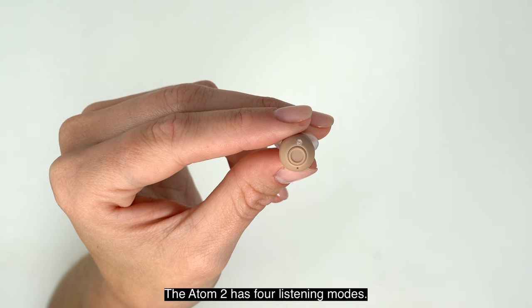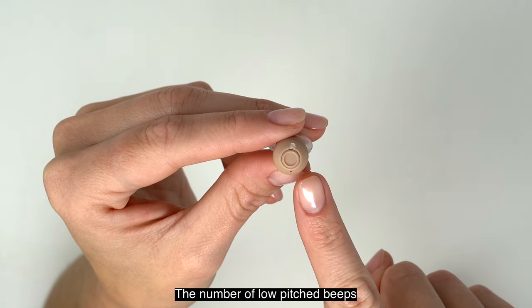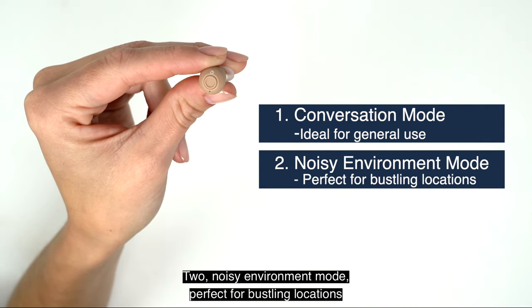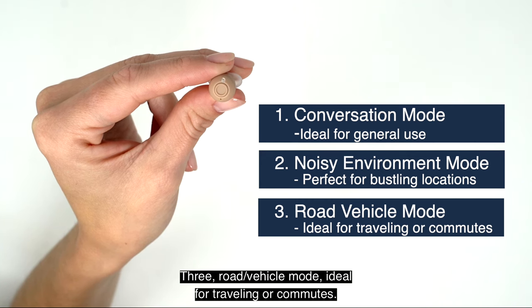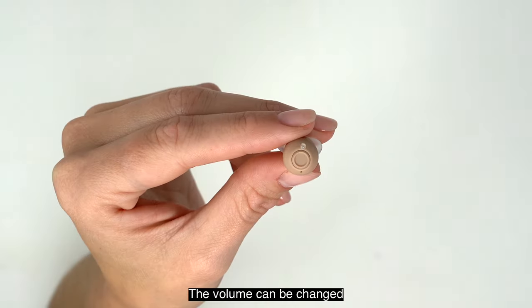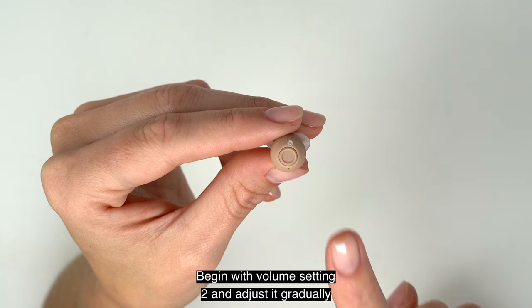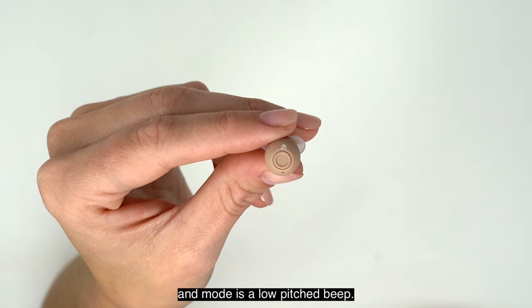The Atom 2 has four listening modes. Simply press and hold the button for three seconds to rotate between modes. The number of low-pitched beeps indicates which mode you are on: 1) Conversation Mode — ideal for general use; 2) Noisy Environment Mode — perfect for bustling locations such as restaurants or cafes; 3) Road Vehicle Mode — ideal for traveling or commutes; 4) Outdoor Mode — suited for nature or park visits. The volume can be changed by pressing the button on your hearing aids. The device offers five volume levels, signified by the number of high-pitched beeps you hear. Begin with volume setting 2 and adjust gradually. Note: volume is a high-pitched beep and mode is a low-pitched beep.